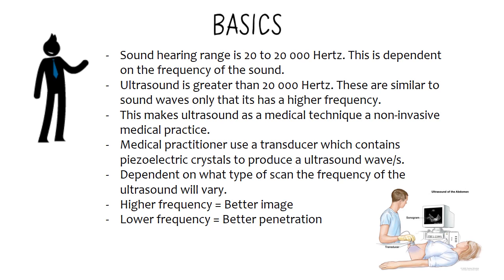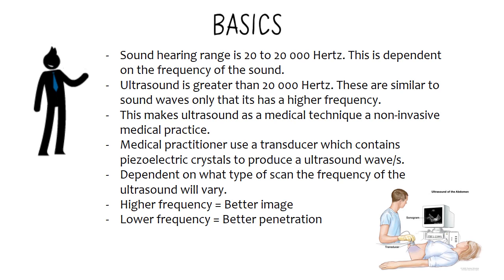Sound hearing ranges between 20 to 20,000 Hz, and this is dependent on the frequency of sound. An ultrasound is greater than 20,000 Hz, and these are similar to sound waves, only that they have a higher frequency. This makes ultrasound a medical technique that is non-invasive in medical practice.